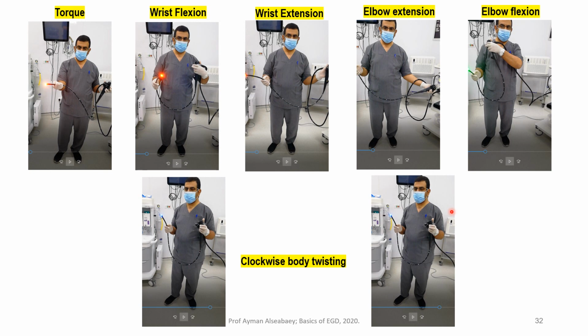These are the main movements, and by catching the endoscope in such a way and doing these movements in such a way, you will not use the right-left wheel completely. Okay, so you will keep your endoscope intact and you will preserve it.